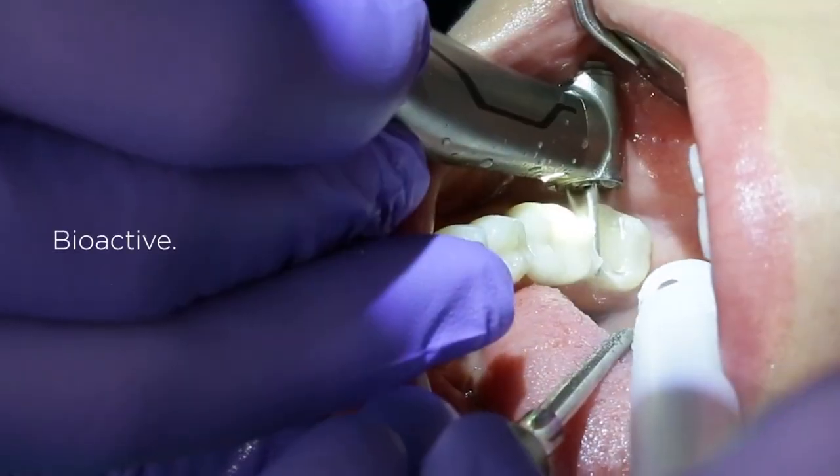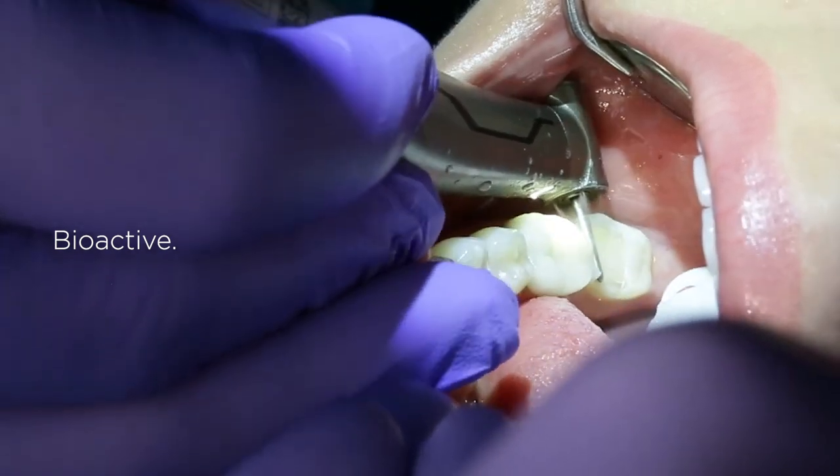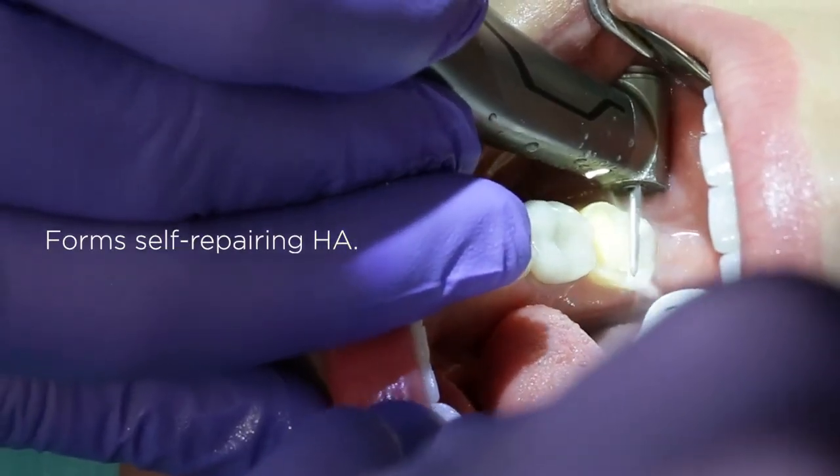Calibra Bio Bioactive Cement is ideal for posterior zirconia and metal restorations because it works well with moisture, offers easy cleanup, and forms a self-repairing hydroxyapatite layer that protects the marginal interface.